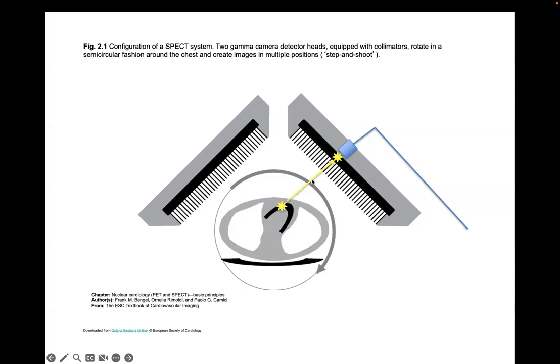If that photon comes out on this straight yellow line here, and it gets through this thing called the collimator, it will make a flash of light, usually in some kind of detector material, and that light is then detected by something called a photomultiplier tube, and then a signal pulse comes down the wire to your computer. And so that's the basic physics of how it works.